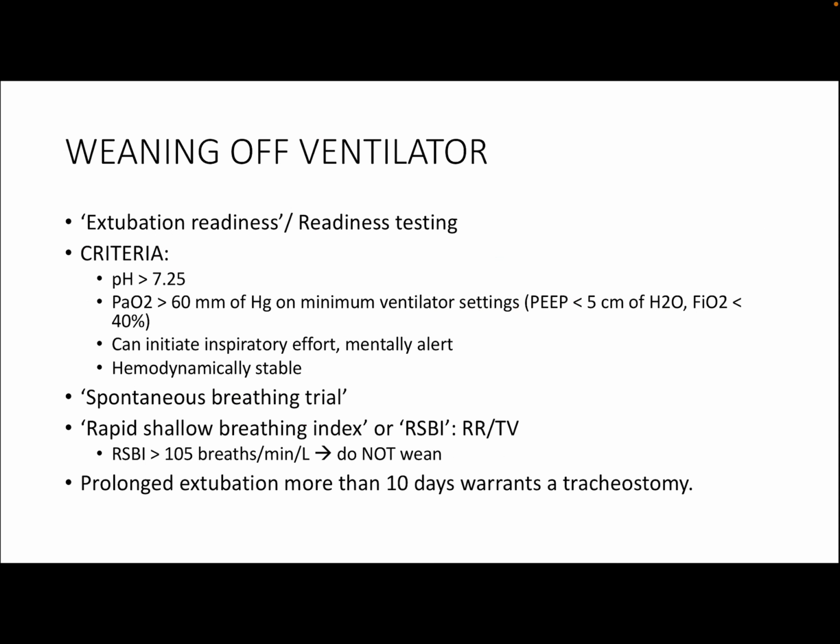Coming to the next topic. So we have talked about the ventilator settings in ARDS, ventilator settings in COPD. Now, how do we wean the patient off of the ventilator? This is called extubation readiness, and it is associated with something called readiness testing.